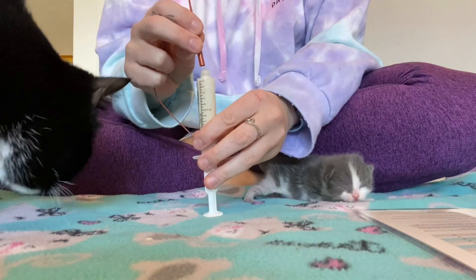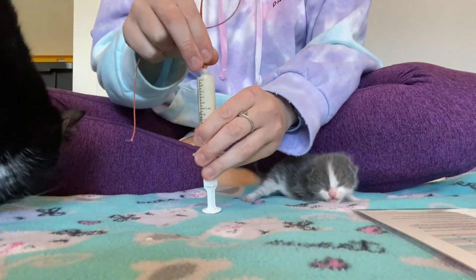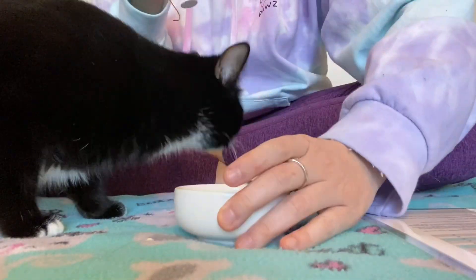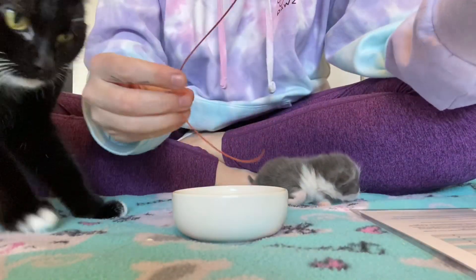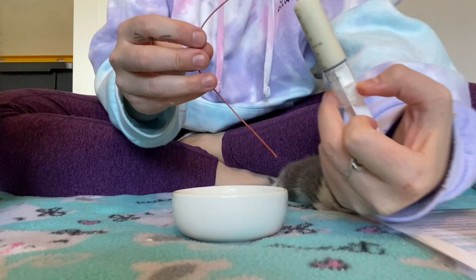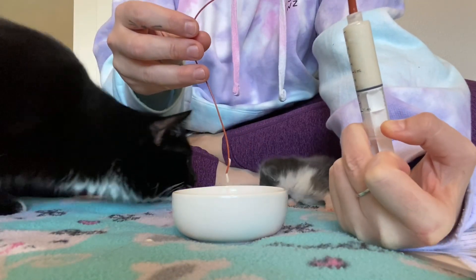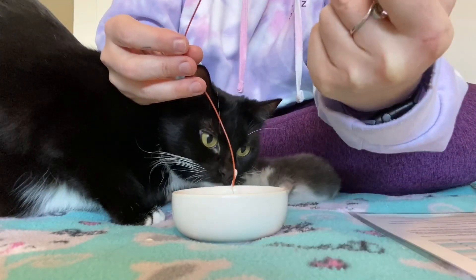Now we're going to attach our tube. Make sure it's on there nice and tight. And now I am going to push the syringe in that position so that the air runs through the tube and we get any air and bubbles out.